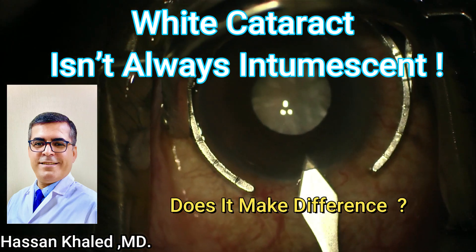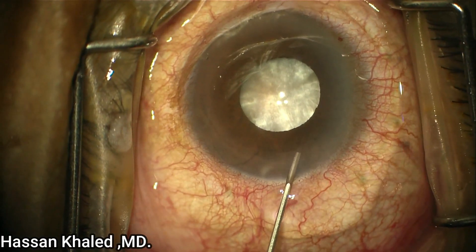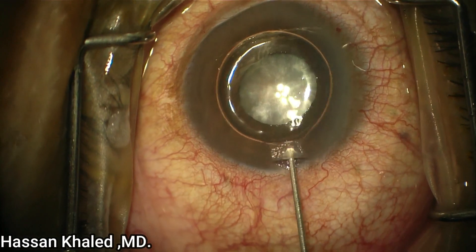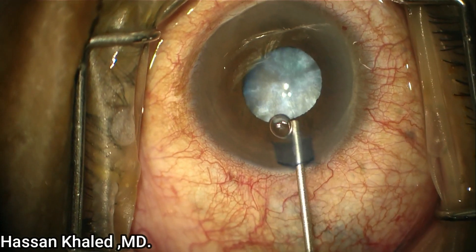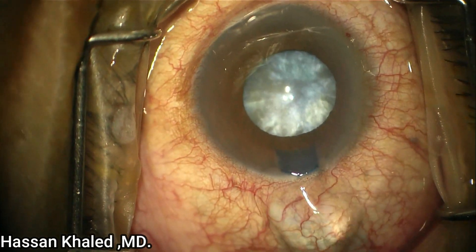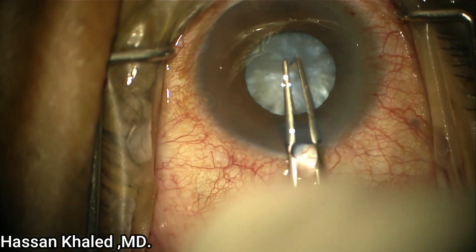Hello, I am presenting a case of phacoemulsification of a white dense cataract. I started with a 2.4mm clear cornea incision, injecting mydriatic, but unfortunately the pupil doesn't dilate. Here you can see staining of the anterior capsule using trypan blue underneath the air bubble, then injecting dispersive OVD. You can see the pupil is slightly dilated with the OVD injection.